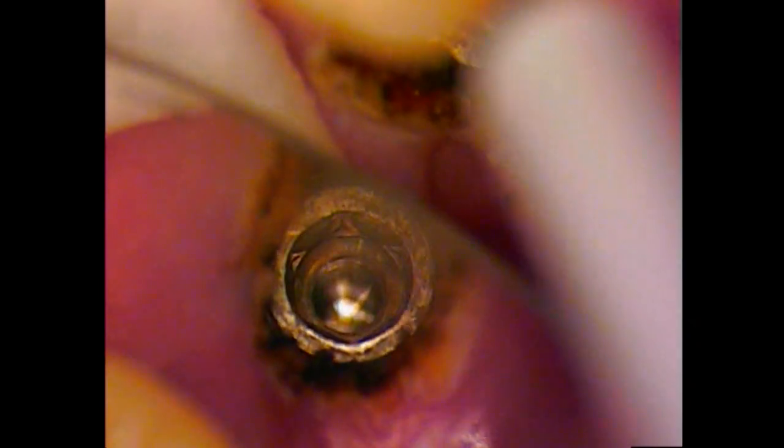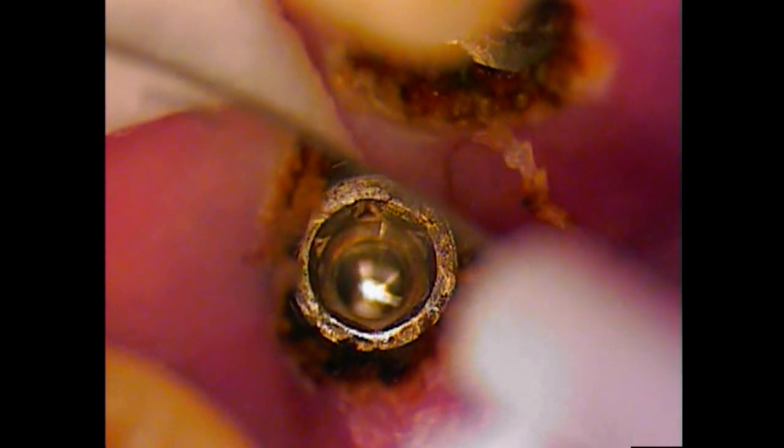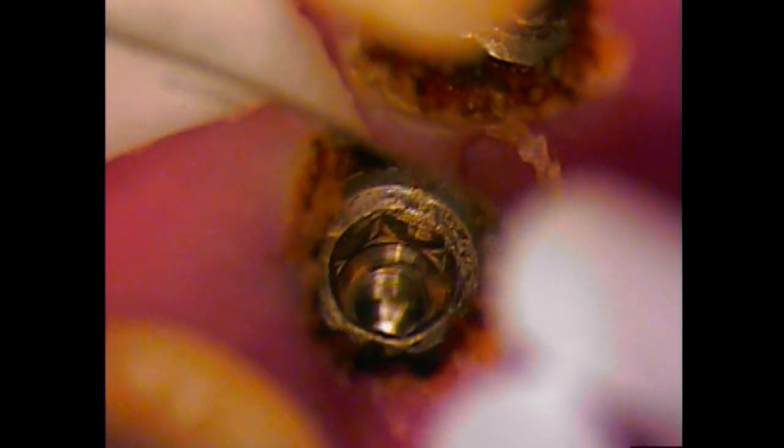Sorry for the foggy mirror here. We'll just follow that up again. There we go. All right. And you notice that everything looks well intact. There are no abrasions. And I can see internally, a little bit on the external side, but not internally. So the referring dentist did give us a healing abutment.